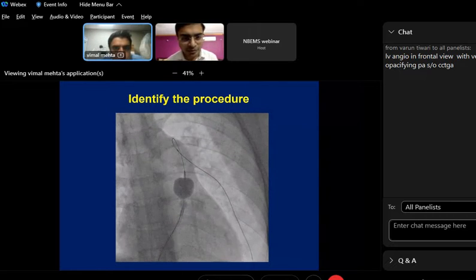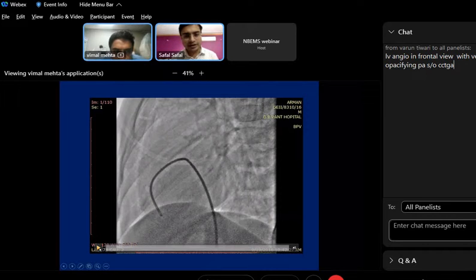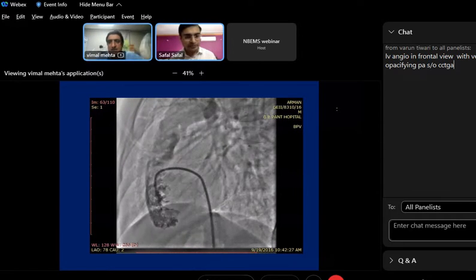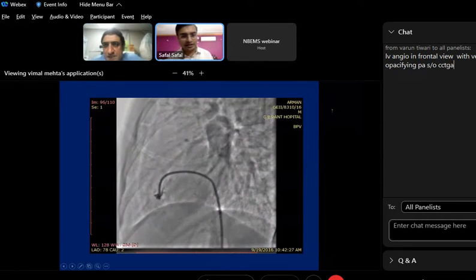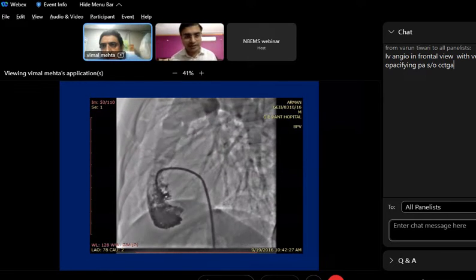So if you could go back to the first. Yeah, please, sir. And for each of the answers that they have given, we'll just tell them the mistake they were making in the first one. Yes, please. You take over, sir, please. In the one just before this, the AP view that was there.